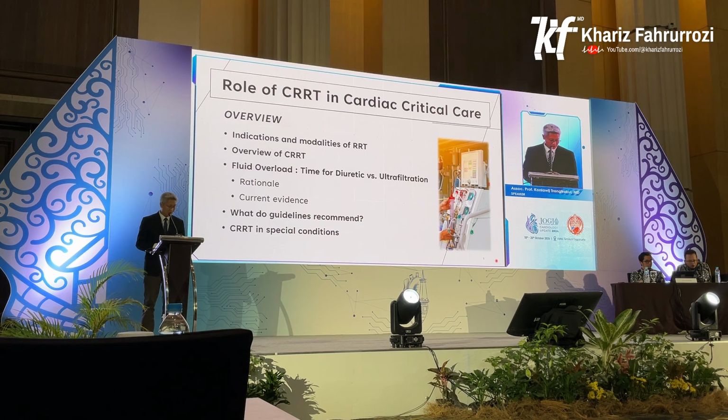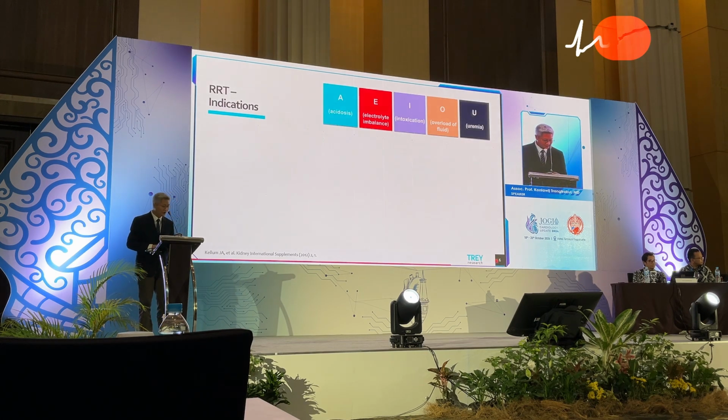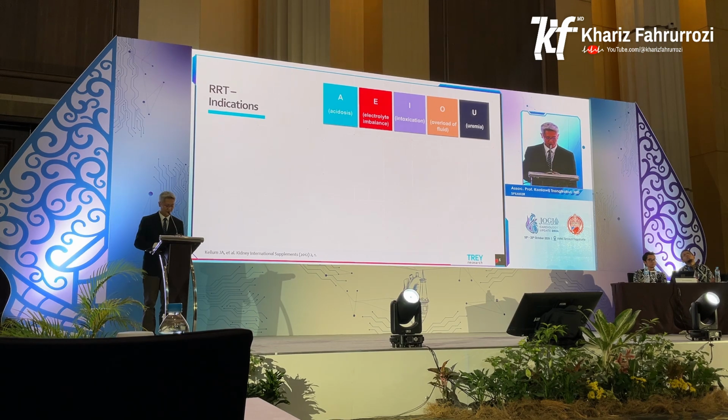And I will go a little bit into the guidelines. What does the guideline say about the role of CRRT or fluid removal? And the last thing, I may focus a little bit on special conditions in which we might use CRRT for our patients. You already know this mnemonic, which is an easy way to memorize the indications for CRRT.